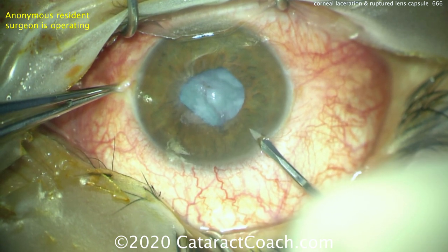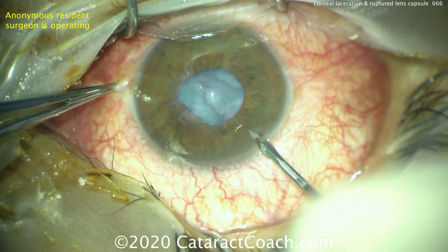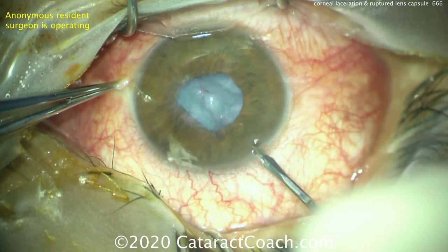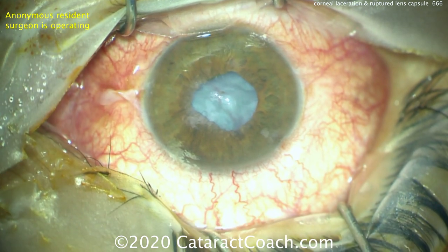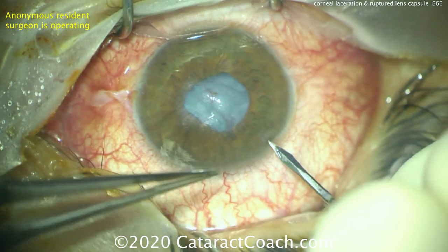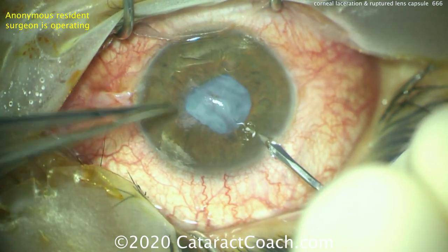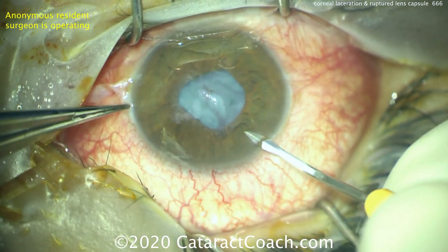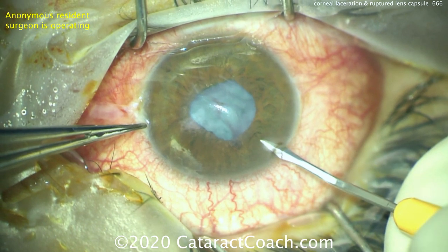The first step is a paracentesis incision. It's tough to make in this flat anterior chamber, this open globe, but it allows us access to fill the eye with viscoelastic. If you have trouble initially, change your path, do what you need to do, fixate the eye — but you need to get a reasonable paracentesis into the anterior chamber.